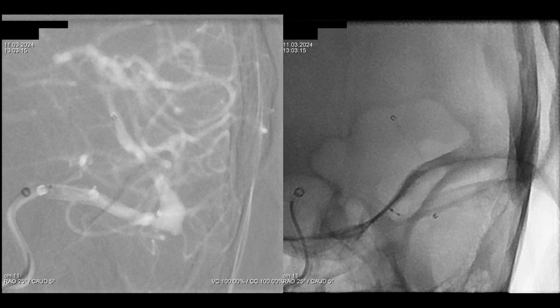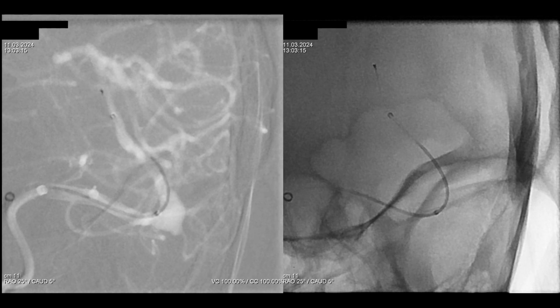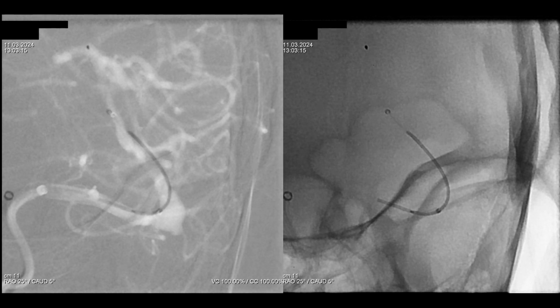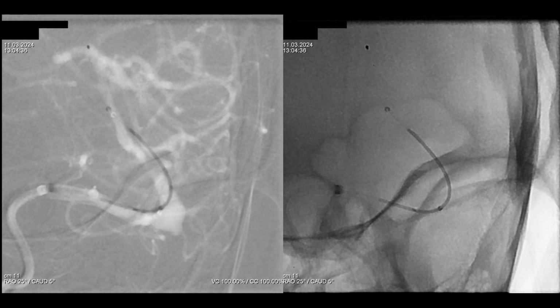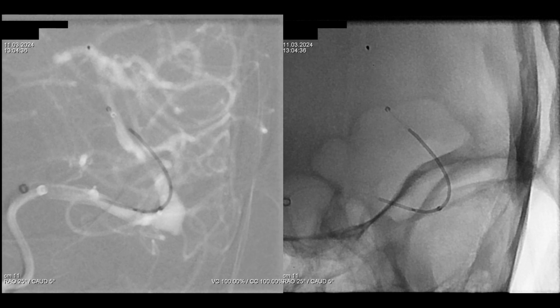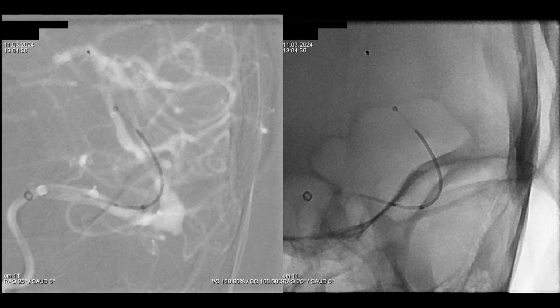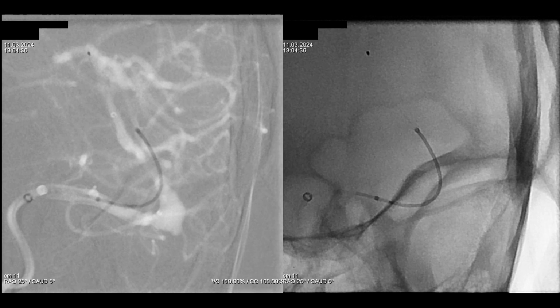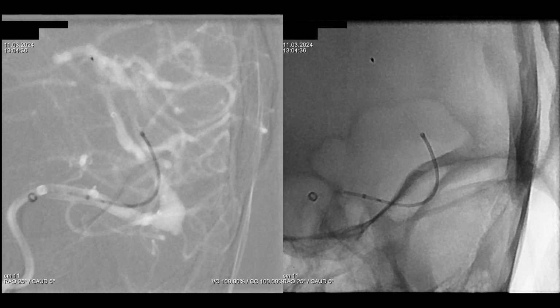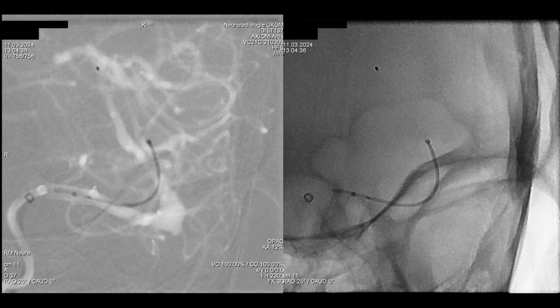As you can see, distally, we have the olive of the flow diverter, and the dark segments of the flow diverter are the real flow diverter. After pushing the flow diverter, we have again a little bit of anatomy shift, and we are trying to pull the microcatheter at the distal end of the flow diverter, and now we need a 2D angiogram again to see the anatomy after this massive anatomy shift.